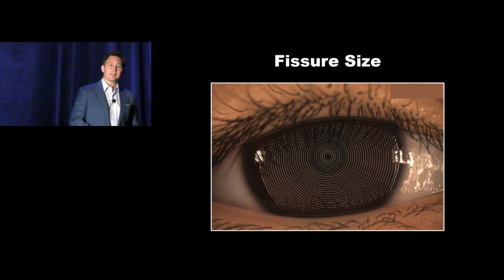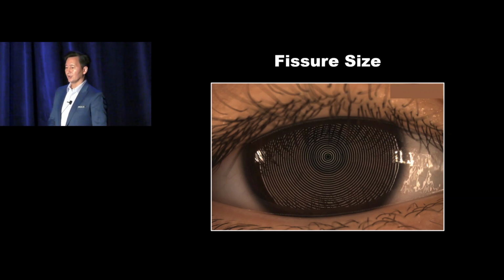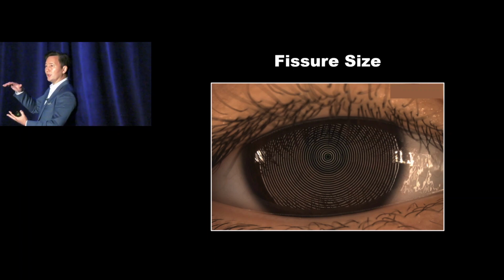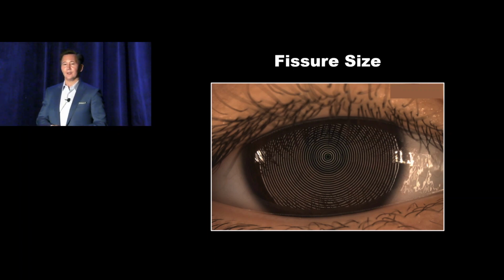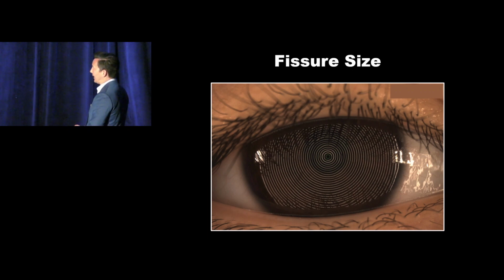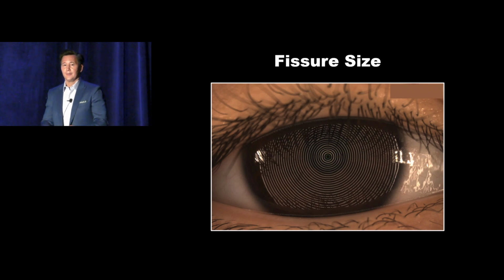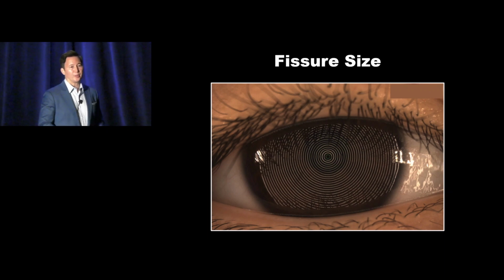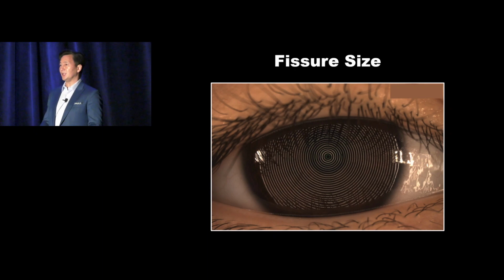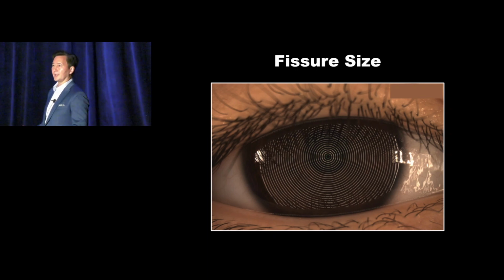Okay, so you've got this capture. Is there anything wrong with this image? And of course, we've got lid and lashes blocking a good percentage of the iris. And then look at the eyelash shadows that you can see right down here. They're making it past the midpoint of the eye. So all those eyelashes are blocking data from getting back to the instrument. So get those lids and lashes open as much as possible. Now, I know we're imaging mostly kids. They may have eyelashes that are pointing straight forward. They're going to be tough, but do whatever you can to get that out of the way.